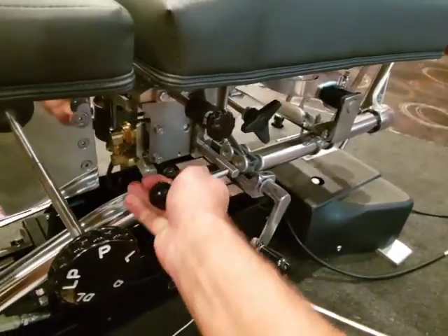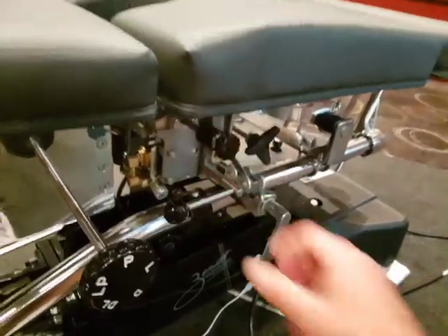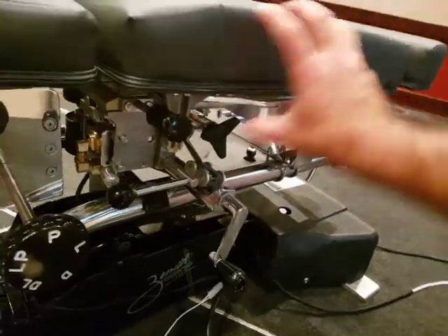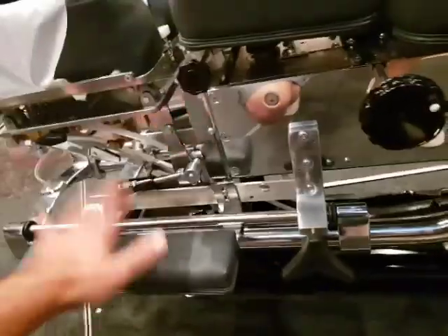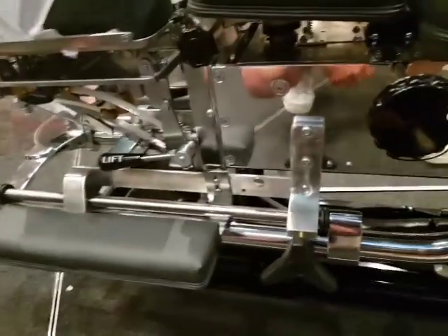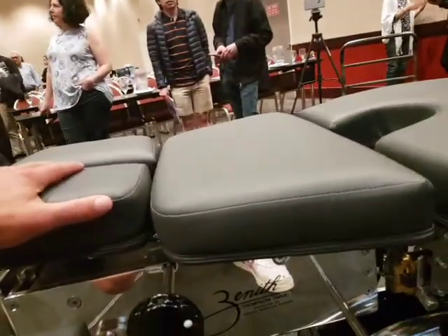To return back to normal, the pelvic tension adjustment is here. To move the pelvic section up and down, undo this and slide it up and down. To slide the table itself, undo the claw and slide the table along.